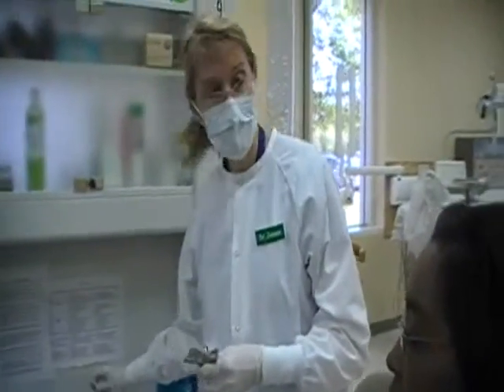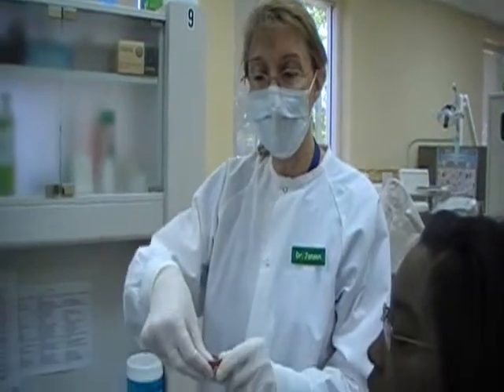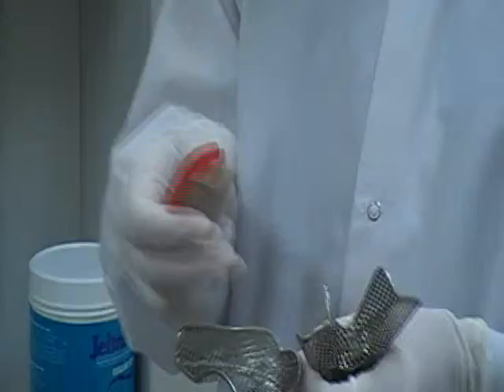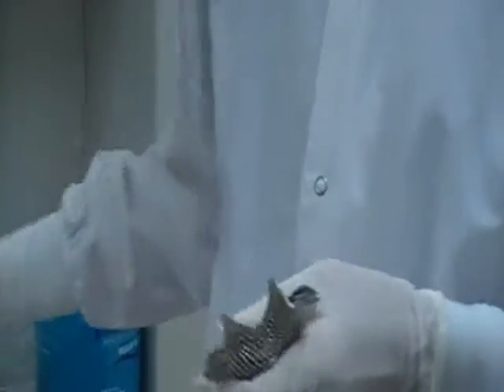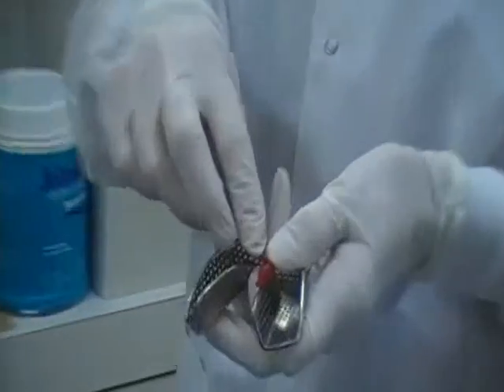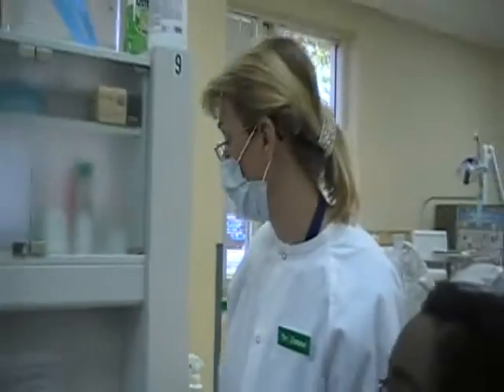Now, once in a while, if the tray doesn't quite extend far enough back, you use rope wax and you basically press it on and adapt it to the back part of the tray — either the maxillary or the mandibular — to give you a little bit more room. If the patient has mandibular tori, to make the impression more comfortable, you can pad the impression with the rope wax as well. She does not have a problem with it, so we won't use it for this demonstration.